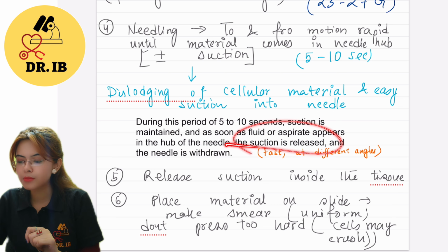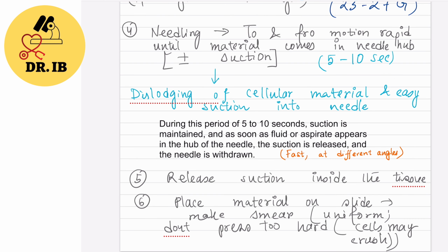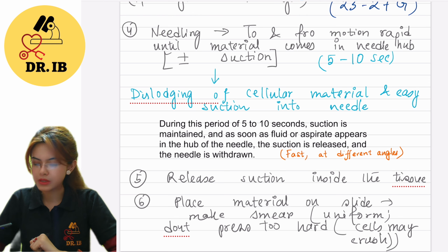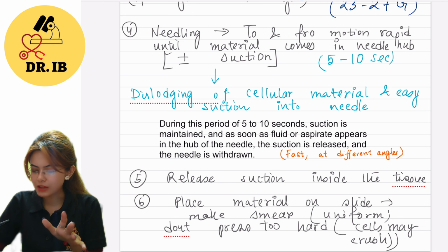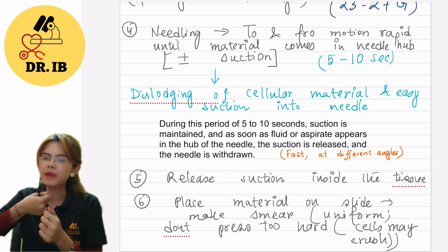A very, very important point is that the suction is released. You have to release the suction. Please release the suction inside, and then only pull out the needle. Okay, so release the suction, place the material on the slide and make a smear.